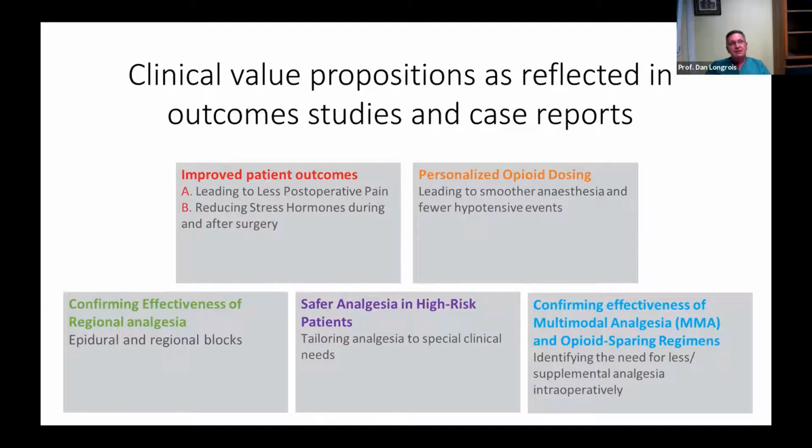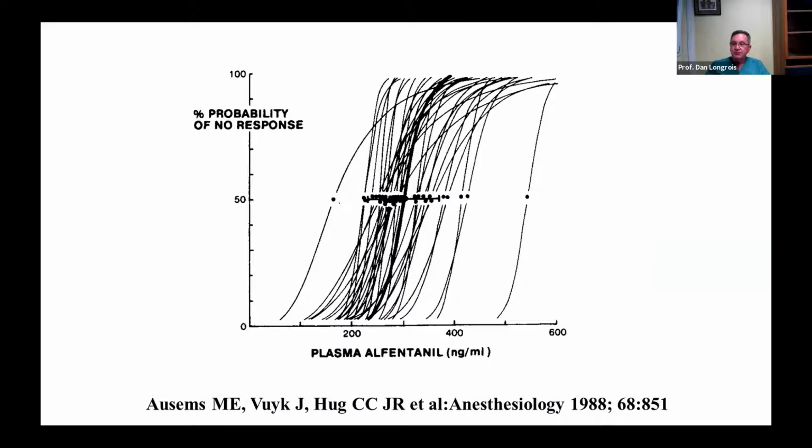And then, of course, this is, I would say, mandatory. If you're using cocktails which go out of the classic hypnotic-opioid interactions and you're using opioid-free regimens, then it becomes absolutely mandatory to be able to read the effectiveness of the cocktails that you are using.